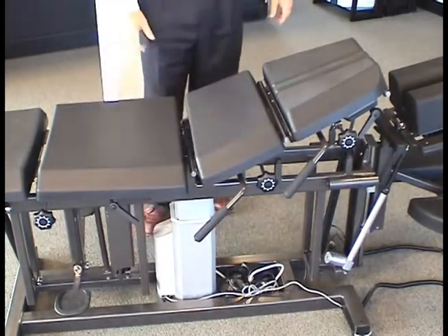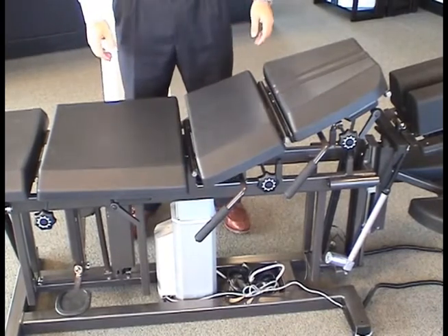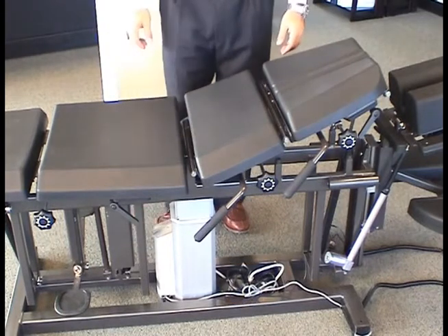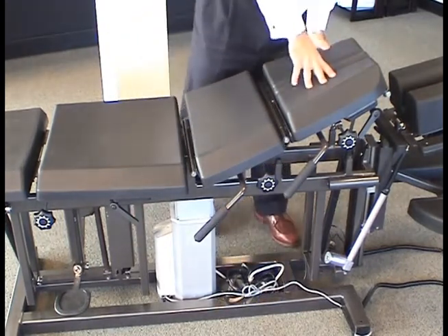If your table is equipped with the optional lumbar foot pedal cocking device, the flying drop is then replaced with a lumbar drop that only functions in the horizontal position.